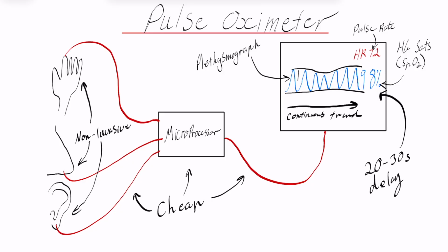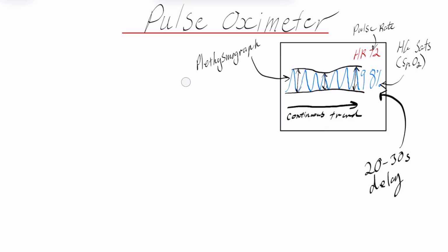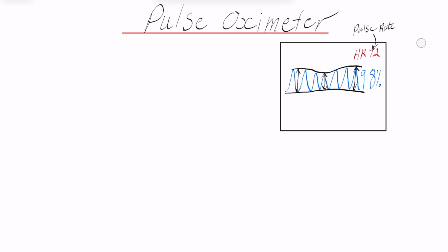And these swings correlate with changes in stroke volume during the respiratory cycle, just like what we interpret on an arterial line as well. It's not perfect, but it can give you a quick, non-invasive clue about volume status. And the reason it does this is due to the physics of how it works, which we'll talk about next.